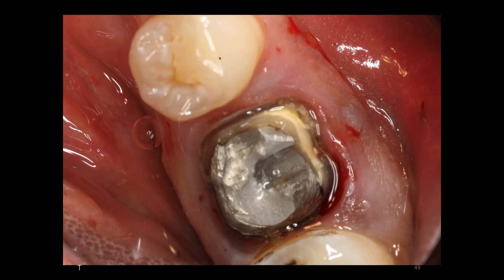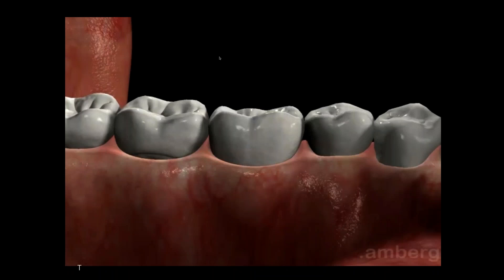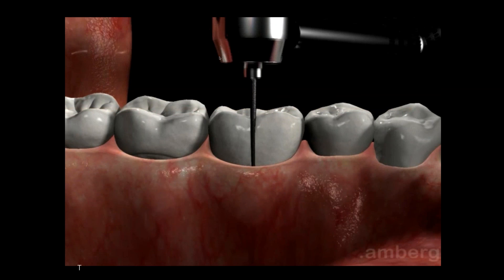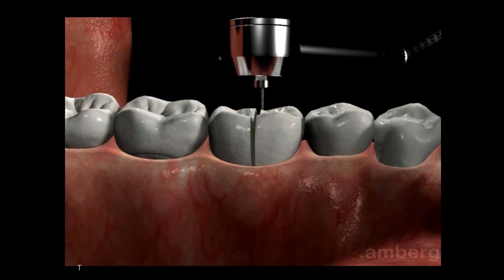I'm simply going to section the roots mesial and distally, and this video shows that it's very important that you use your radiographs to determine correct sectioning. Here we didn't section through the furcation, and thus the tooth is still in one piece.